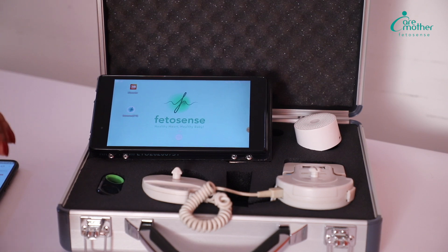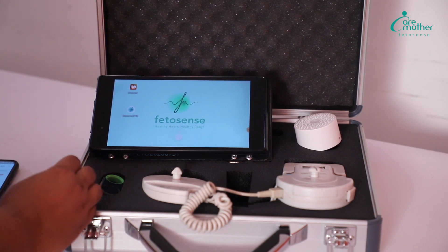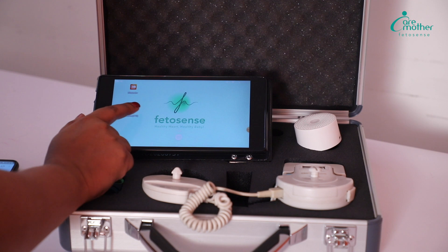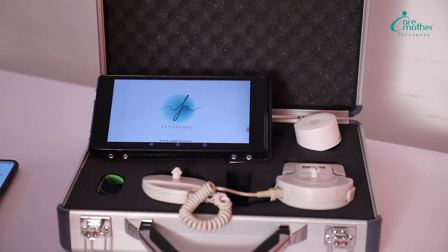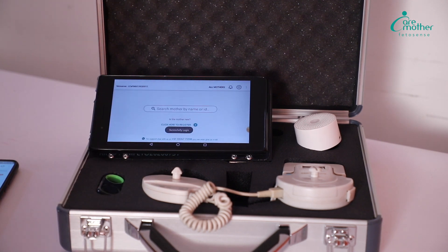Let me show you how to do a test. First of all, when the patient comes for the test, we will click on the app, which is the Fetosense CTG app.